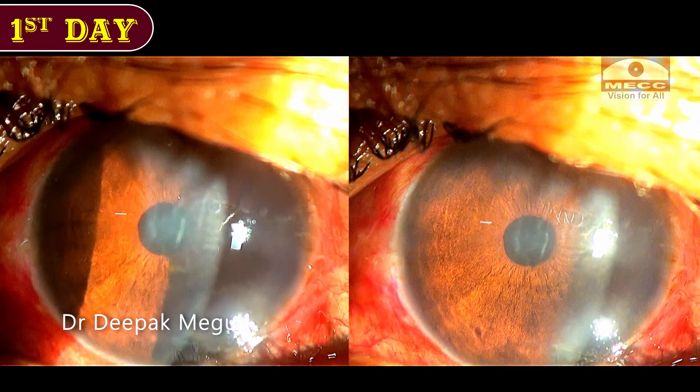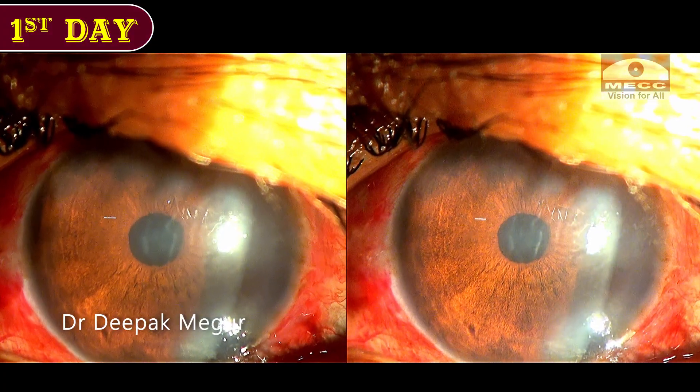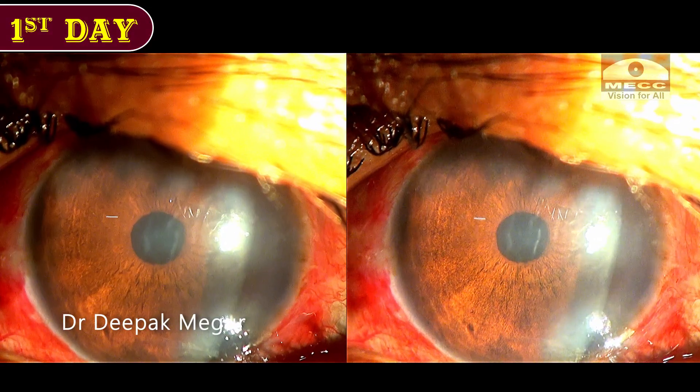This is a picture on the first post-op day. As expected, there is some amount of corneal edema. This is primarily because of the anterior plane of emulsification which was performed in this case.